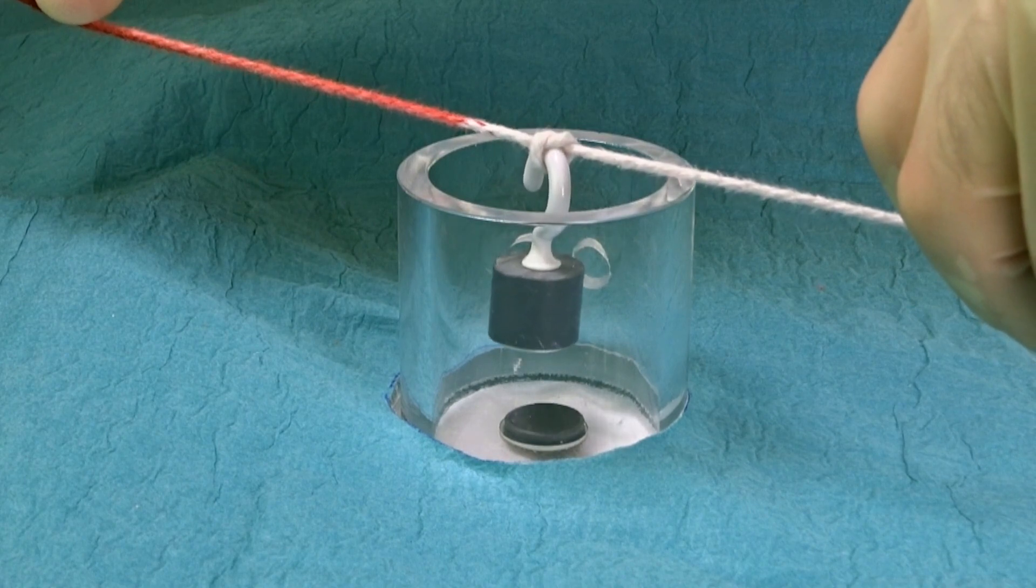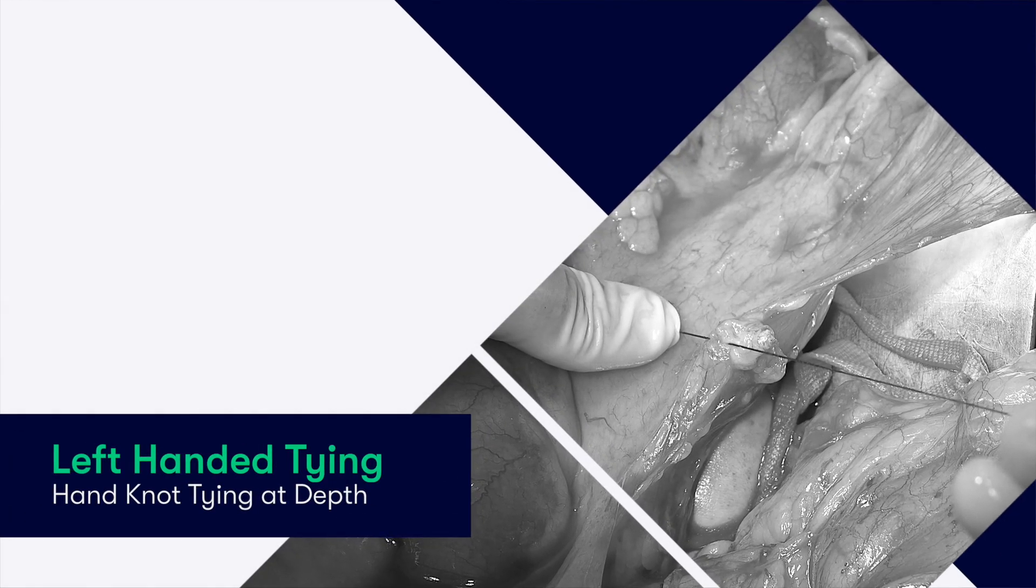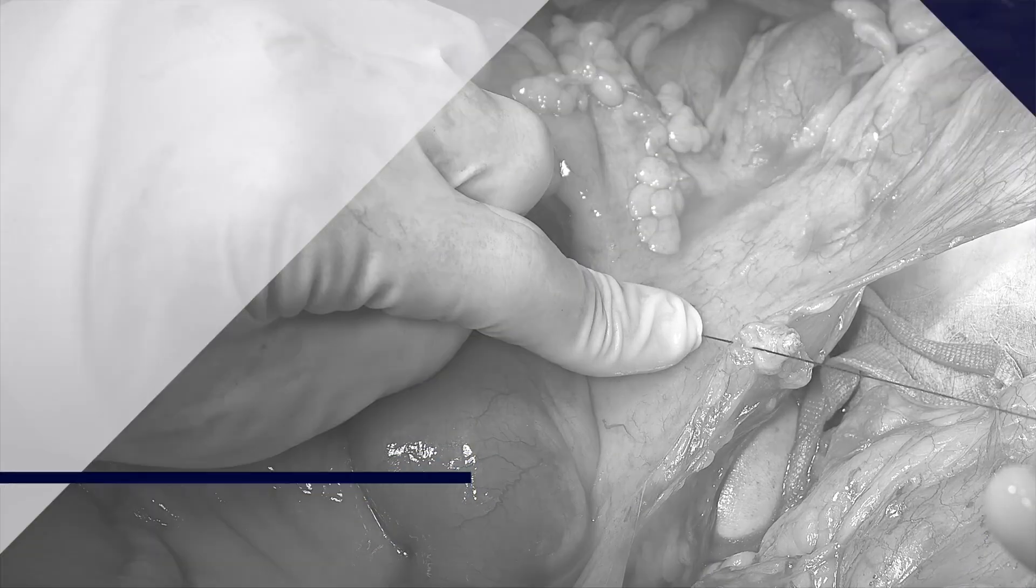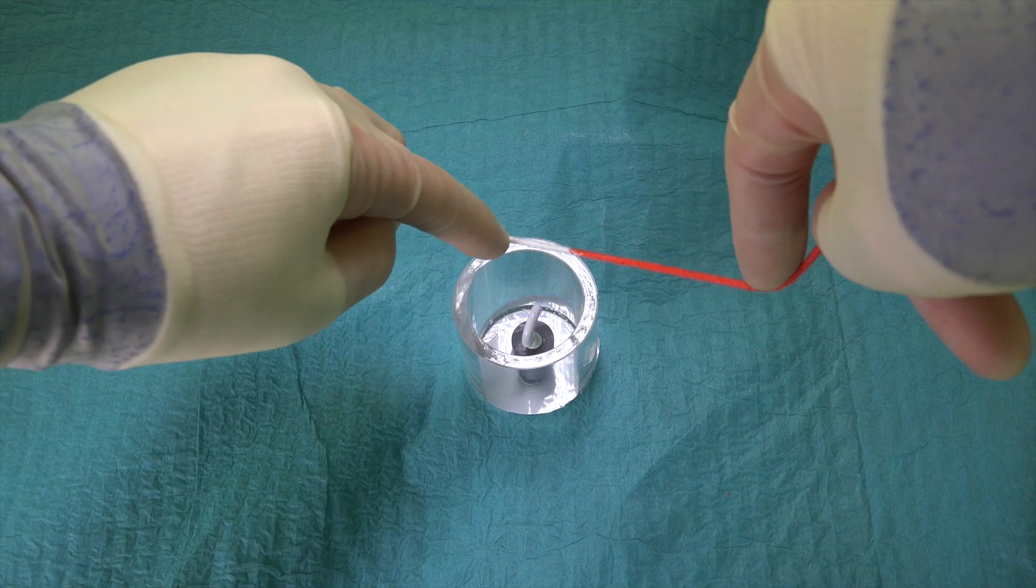So, we need to modify our technique to prevent this from happening. We shall start by demonstrating the technique with the left hand first. We start by hooking the suture around the structure that we should be tying.